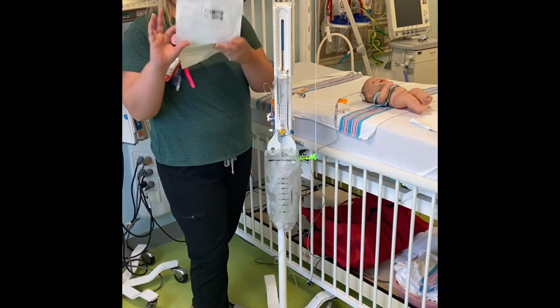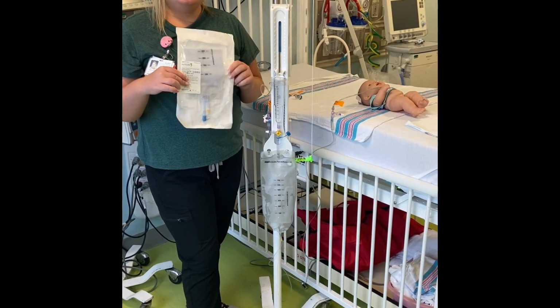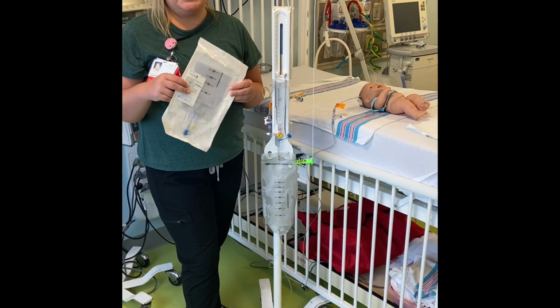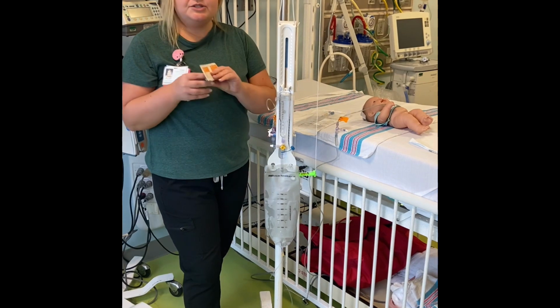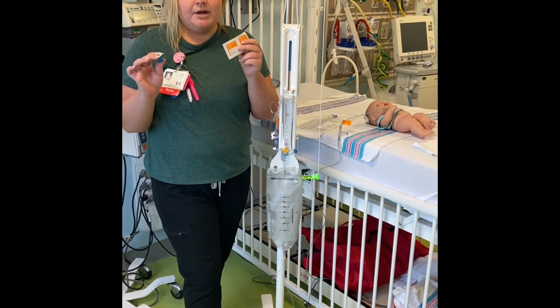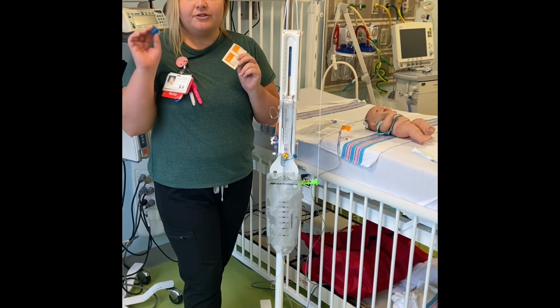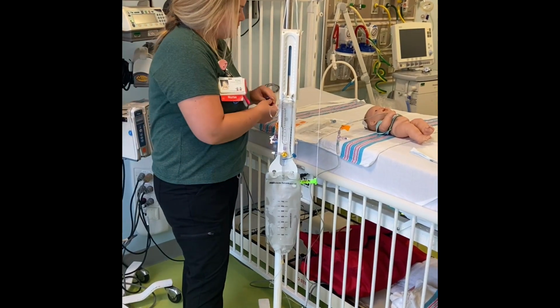So we have our new EVD bag here. These can be found in the Omnicell outside by like 50-51, or they can be found in the Omnicell in third pod. You're then going to use either a site scrubby or an alcohol swab. You never want to use CHG. CHG is neurotoxic. There is no CHG in a site scrub, so you're fine doing either of these.